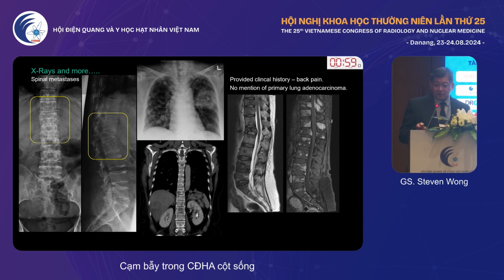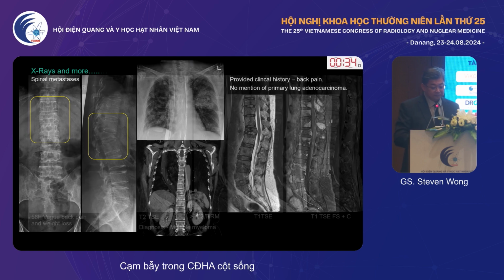Mets, we get asked constantly, is this a new met? Is it an old met? Sometimes I can't tell. You just have to go back and look at as many imaging studies as you can, CT scans, X-rays, whatever you can find, to see whether that is a new metastatic deposit or not. And if it's multifocal, it is easy.